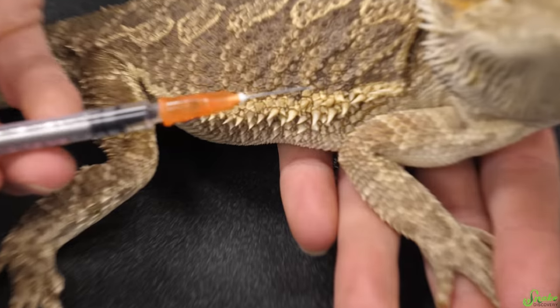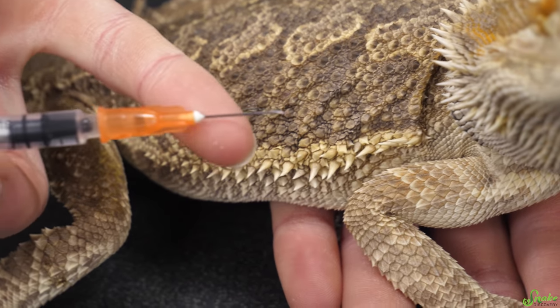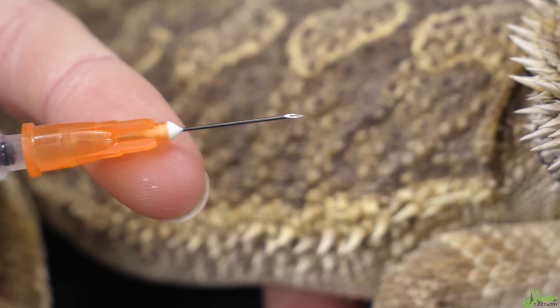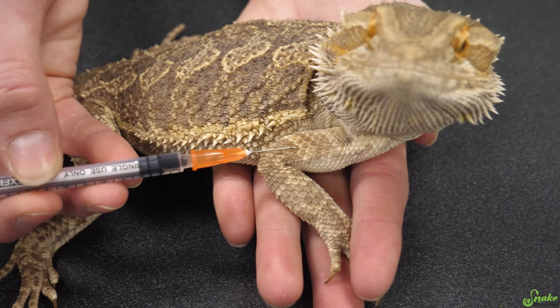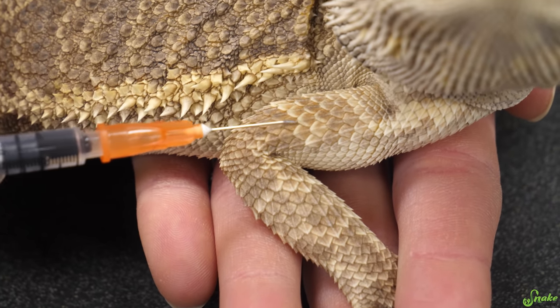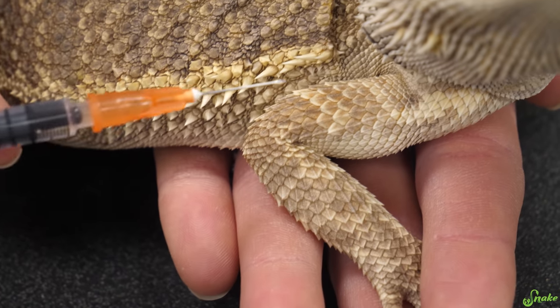When you're giving an injection, try to keep the bevel, or that flat edge of the needle, facing out or away from the body. Apparently it makes it a little bit more comfortable going in, but it's not a huge deal. We're going to go in between two scales, into the skin in between the scales. Obviously you don't want to put a needle through a scale, because you might mess up that scale for the rest of the reptile's life, and it can't be very comfortable poking through one of those hard scales.